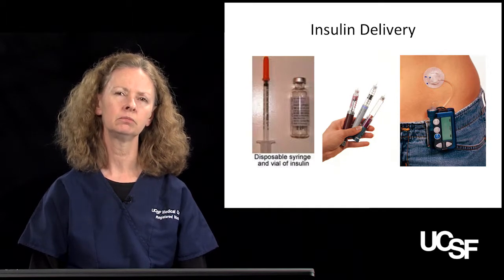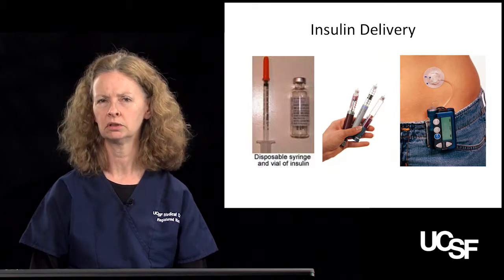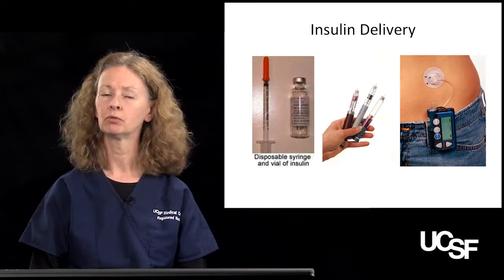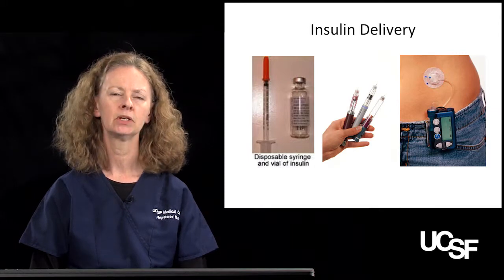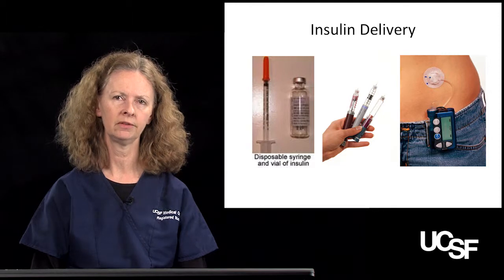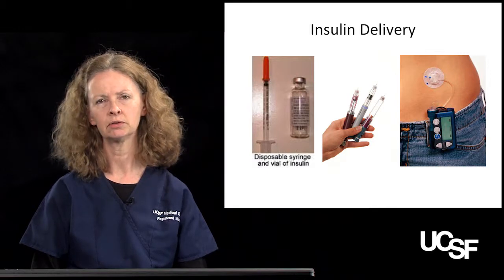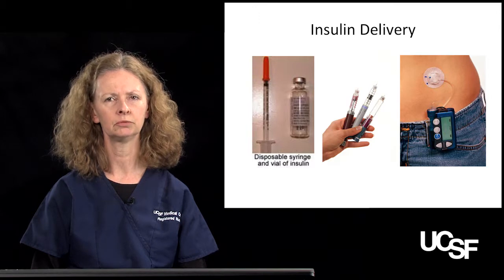So there's a great deal more problem solving that goes into trying to figure out what is wrong when a blood sugar rises, and whether it has to do with the pump, the wrong dose, the wrong carbohydrate count, illnesses and stress. People who are on pumps don't have that chunk of insulin that sits underneath the skin and delivers the insulin to them continuously throughout a 24-hour period. People on pumps can actually develop ketones really quite rapidly.